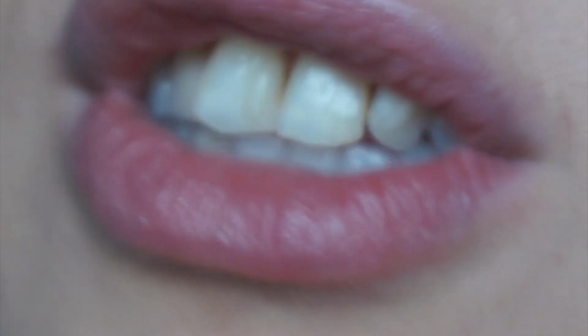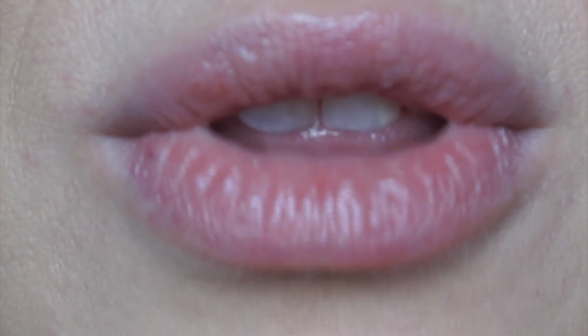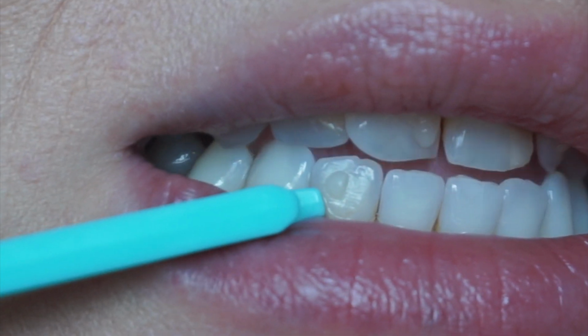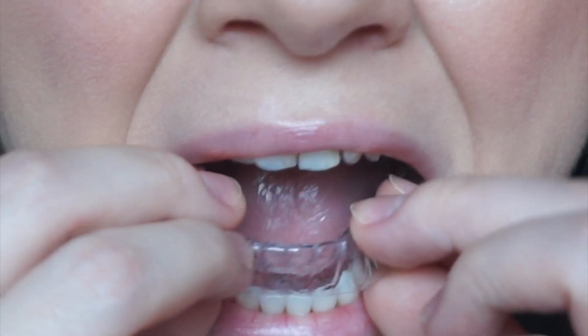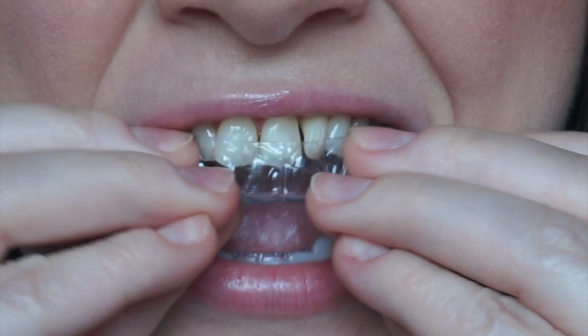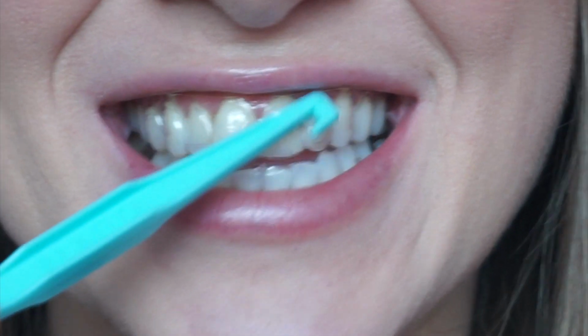It's the color of your teeth. And I have another attachment on the lower tooth, the one that they want to shift. There. That's an attachment. That's it. They fit perfectly. I mean, especially this one.